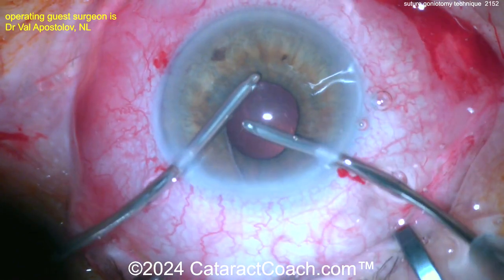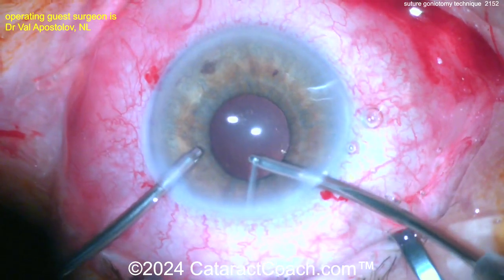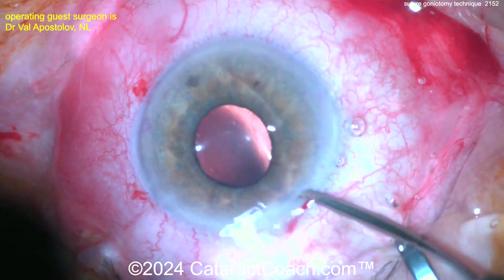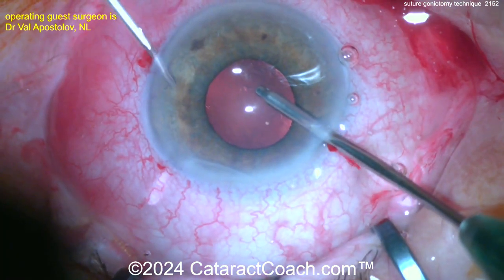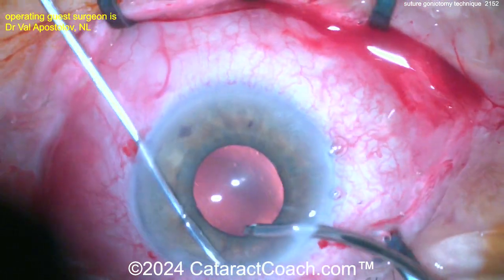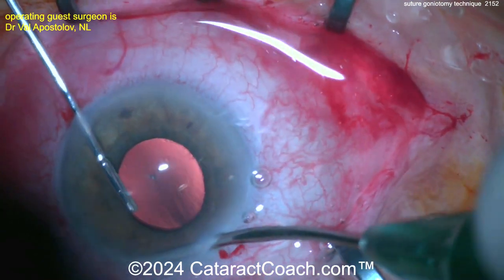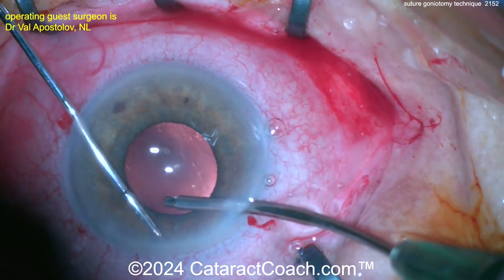Now finishing up — taking out the viscoelastic with a bimanual irrigating cannula. Look at that white strip right there — that, my friends, is the tissue that you unroofed. That can now be grabbed with micro forceps: right hand providing infusion, left hand grabbing the micro forceps, and you can fully strip it off.